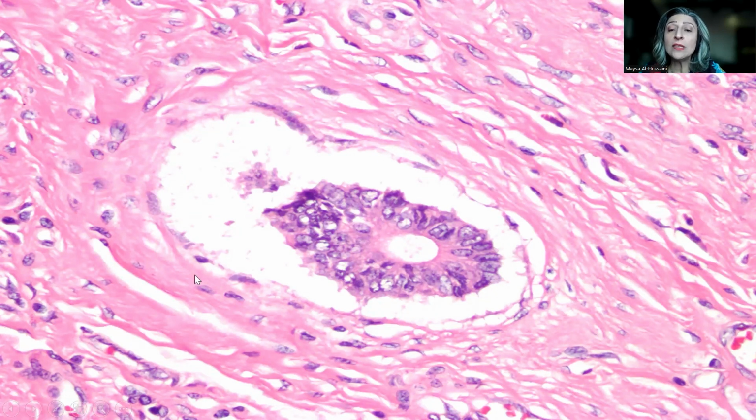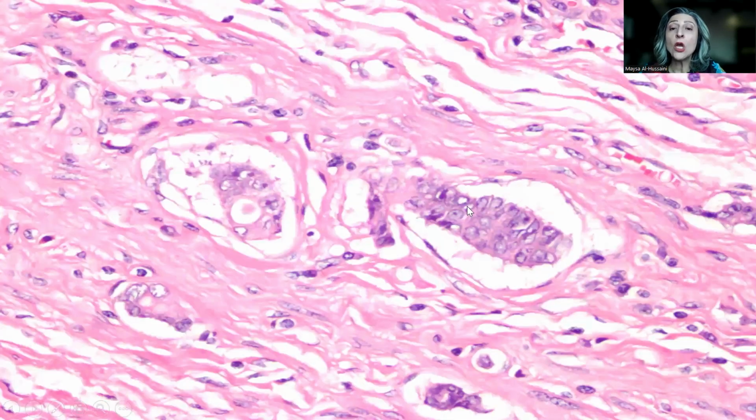So this is not a true lymphatic permeation, it's a pseudo-retraction of the tissue because of the fibrosis around the glands of the tumor cells, which really would induce the idea of probable lymphatic invasion or permeation.